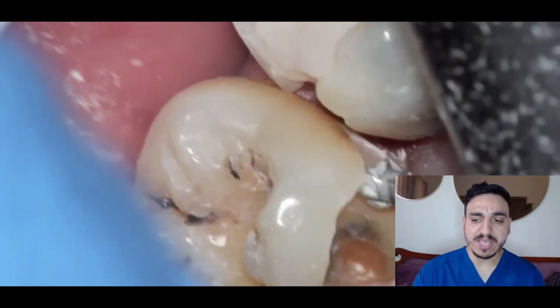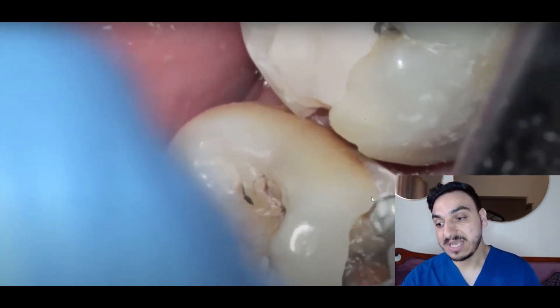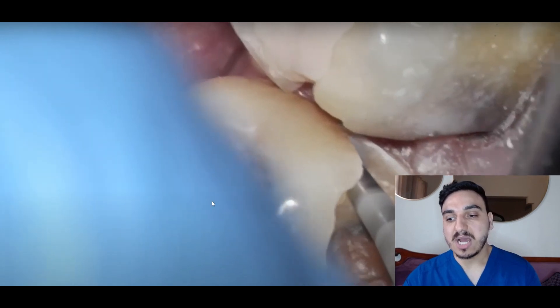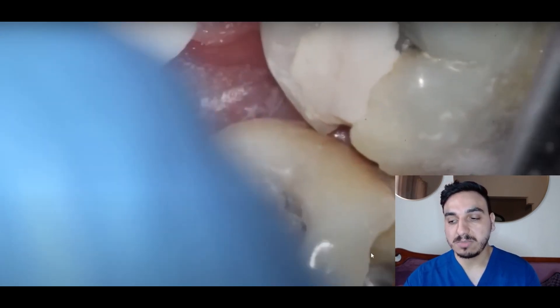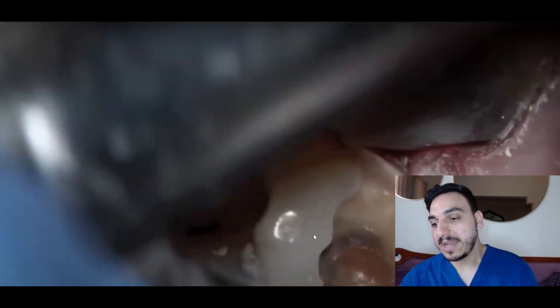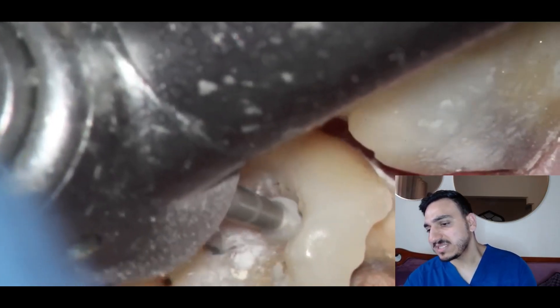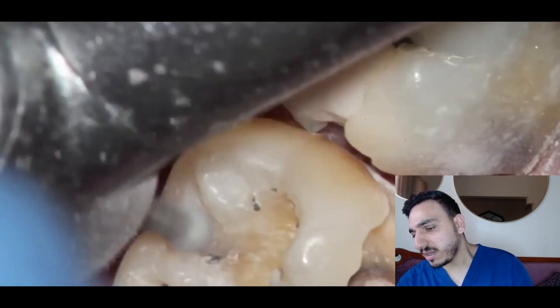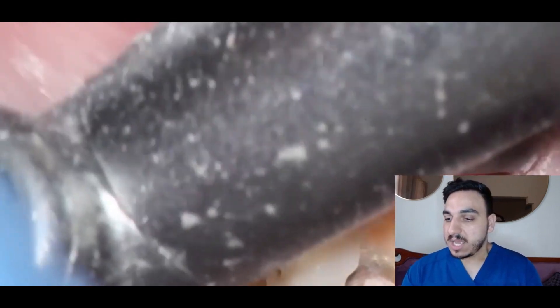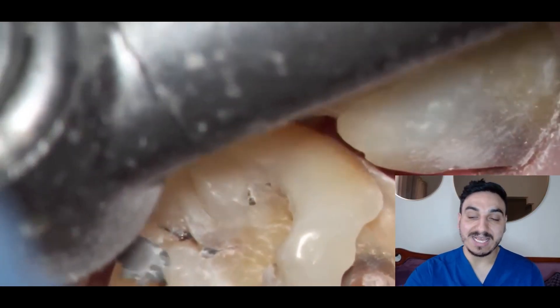A lot of people think: why should they clean between the teeth or floss? Well, because dental decay can also happen in those proximal areas — not only on the chewing surface or visible areas, but even in difficult-to-reach areas like these. It looks like they've removed the silver filling now and are continuing to remove the remaining decay using a handpiece and burr to drill out all the remaining rot.